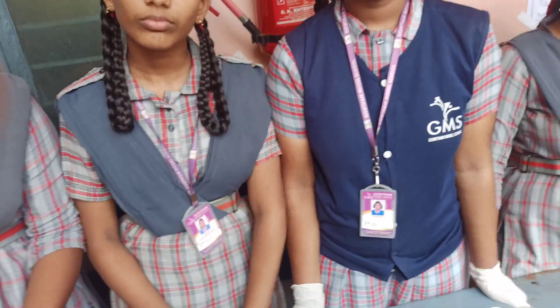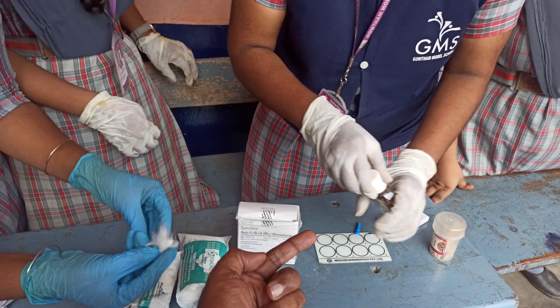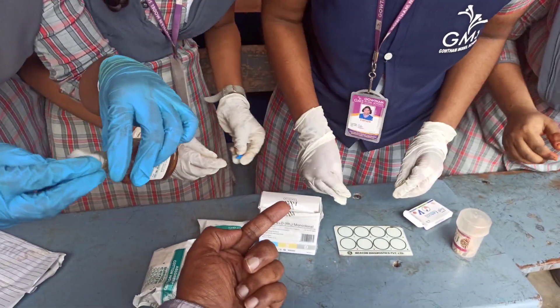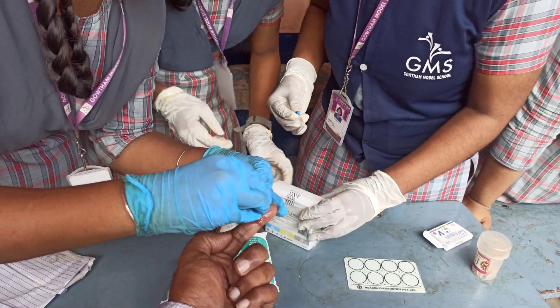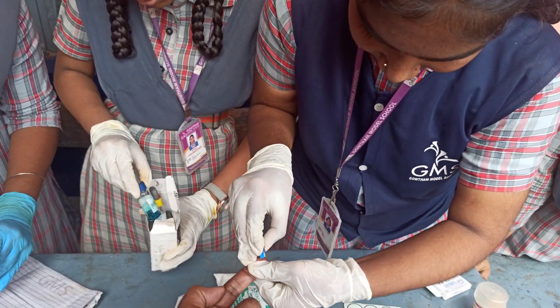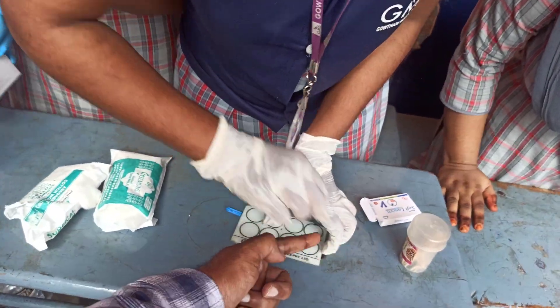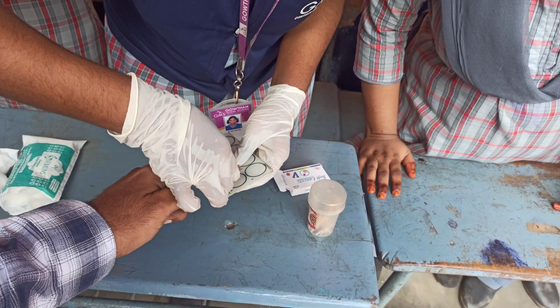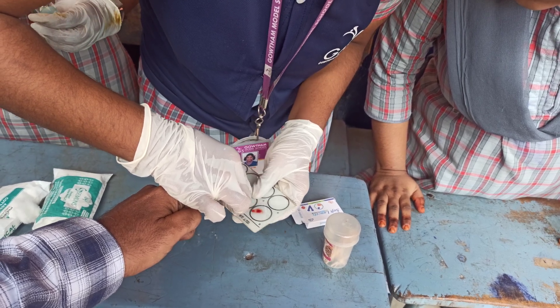1 to 2 minutes. Please test my blood. Please slowly inject. So you are taking my blood to test the blood group.